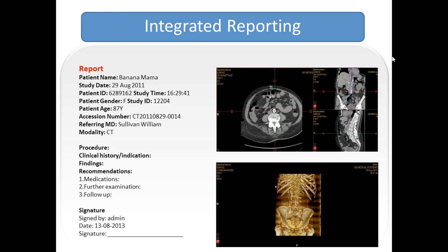And of course, with all those imaging capabilities, it would be foolhardy if we could not include those in the final report. So I mentioned earlier how important the referring physician is. When we send that referring physician the final report, we include the images as well as the annotations that were earmarked by the interpreting physician. But again, they're not just static images. In this example, I'm showing a report template with 2 highlighted images, but we also included an embedded URL link.